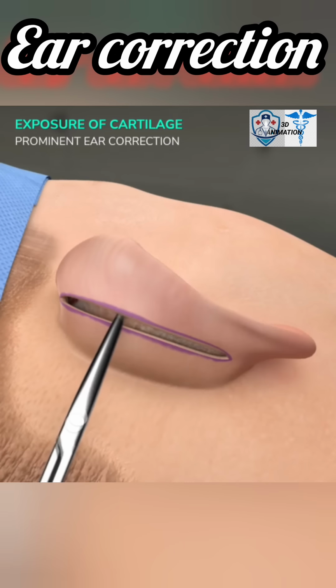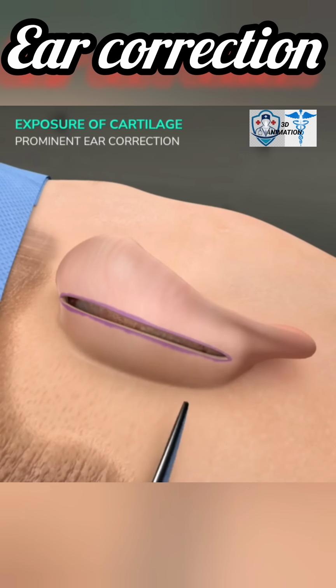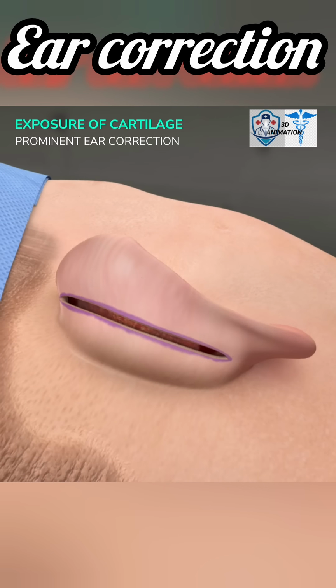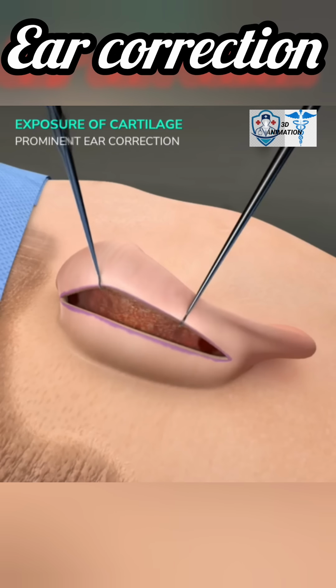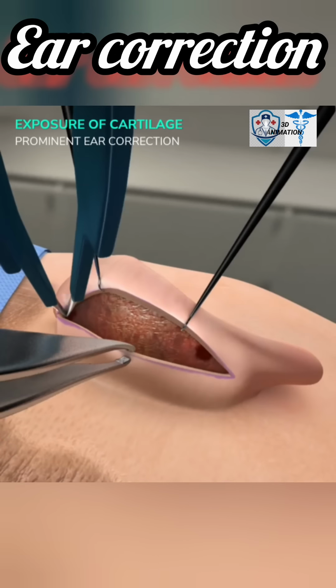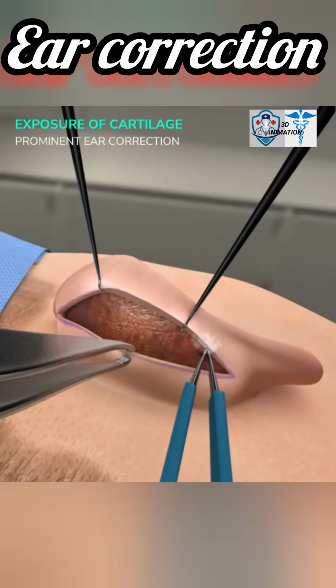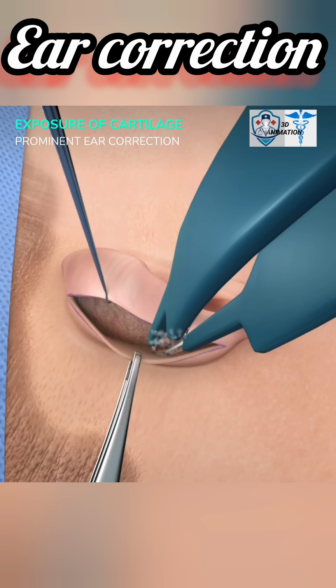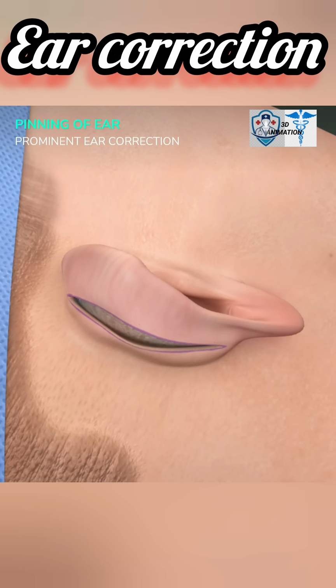Use the scissors to blunt dissect the skin from the cartilage on the lateral side. Use the scissors to blunt dissect the skin from the cartilage on the medial side. Ask your assistant to insert the skin hooks into the lateral edge of the incision and hold the skin up. Use the forceps to lift the skin and the electrocautery forceps to cauterize any bleeding points. Continue cauterizing any bleeding points until the cartilage is exposed and can be visualized.